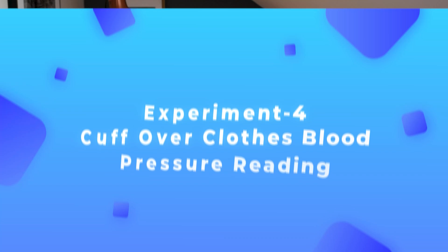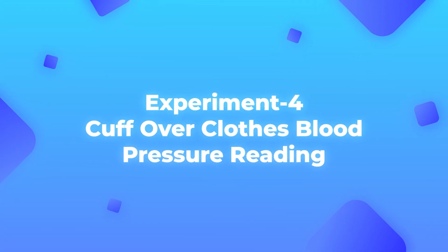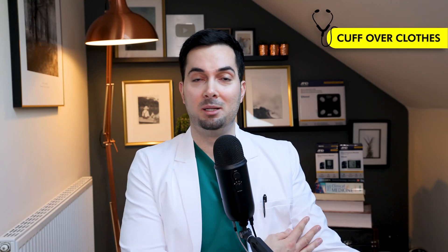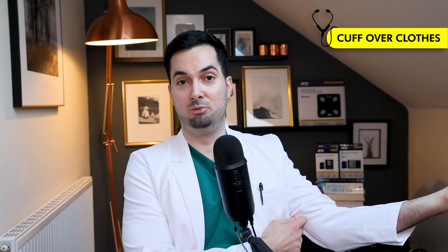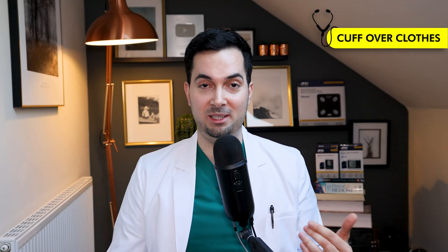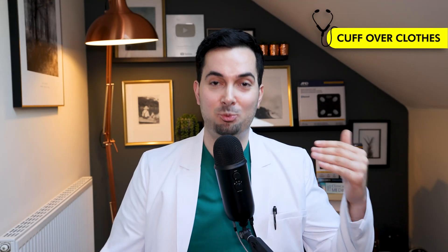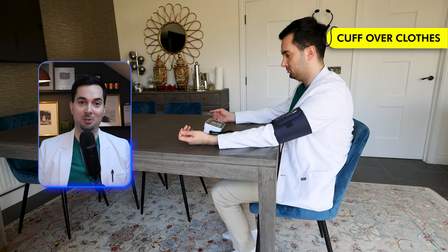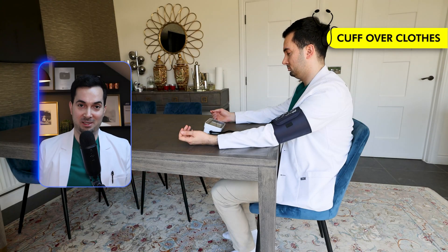Moving straight onto experiment number four — this is one I see very commonly: patients taking their blood pressure over their sweater, their jumper, or a shirt, sometimes because it's too tight to roll up. Again, this is going to affect blood pressure readings. For this experiment, you can see I'm doing it over my white coat. Let's see exactly how this affects the reading.